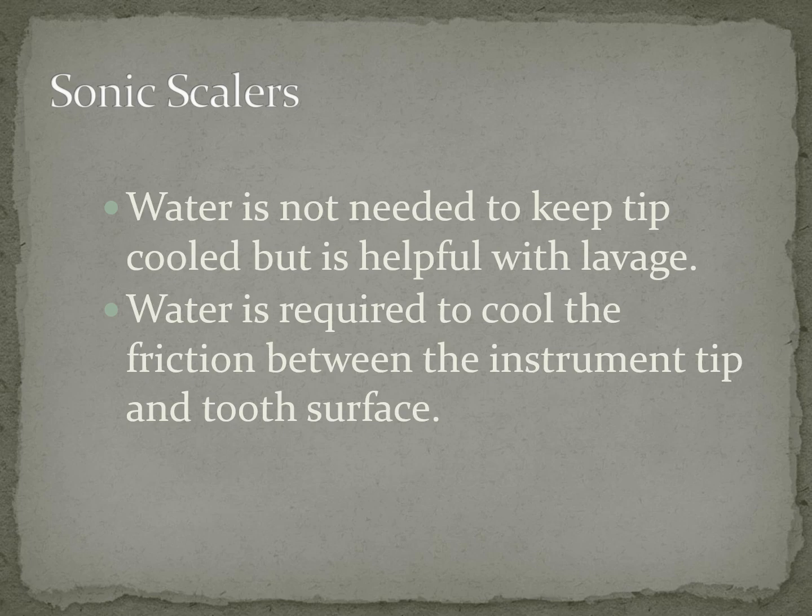So once we start using these, we're going to see chunks of calculus. We're going to see some bleeding. It makes our visibility difficult, but that lavage helps. So that clearing away with the water is going to help us see when we're cleaning. So water is going to be required to cool the friction then between the instrument tip and the tooth surface. So never use these instruments, whether it's sonic or ultrasonic, never use these instruments without water.